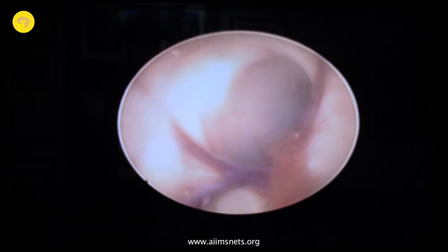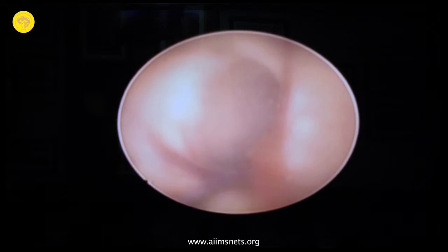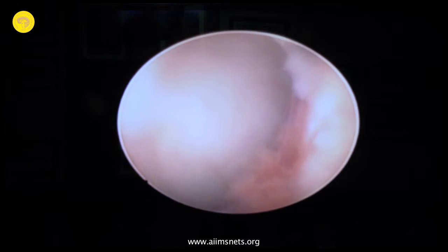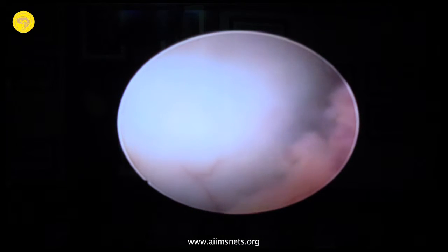You'll reach the ventricle subsequently, and you see this cyst here, right? You see this beautiful cyst here. Now, here the issue is completely different. So, you think it's again clear CSF inside the cyst.